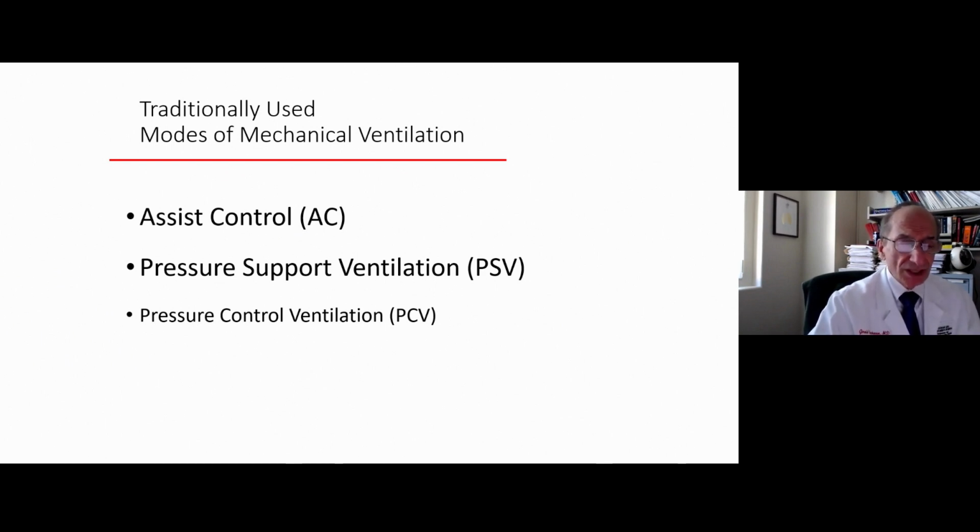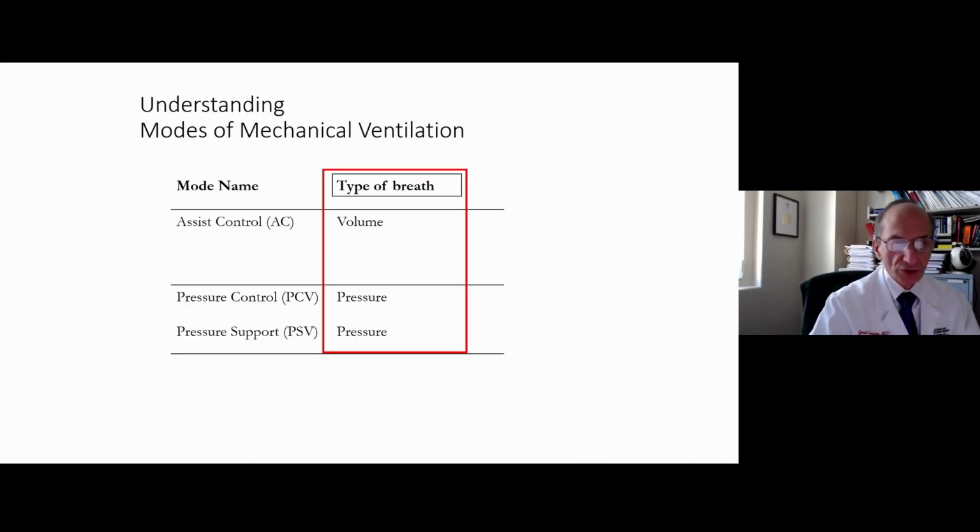And really, if the board thinks any differently and asks about any other modes of ventilation, I would be quite disappointed. I think that would be a very poor choice. These are the modes of ventilation that ventilate probably greater than 98% of our patients. So that's assist control, pressure support, and pressure control ventilation. Perhaps pressure control is slightly less common.